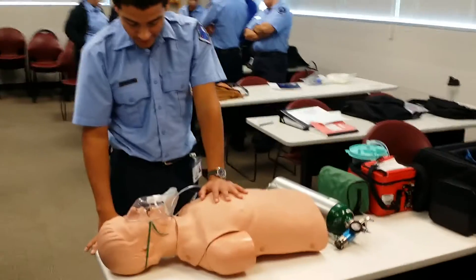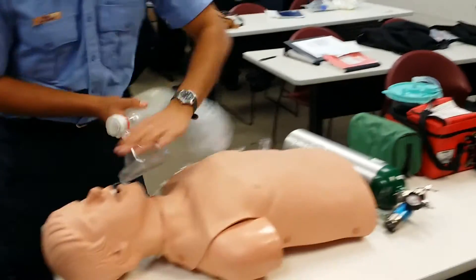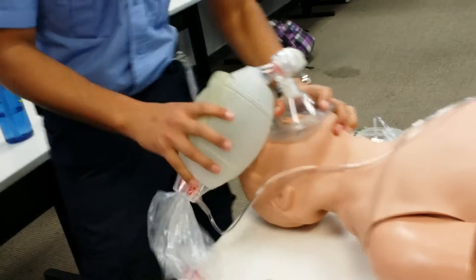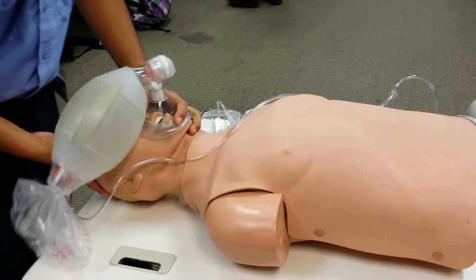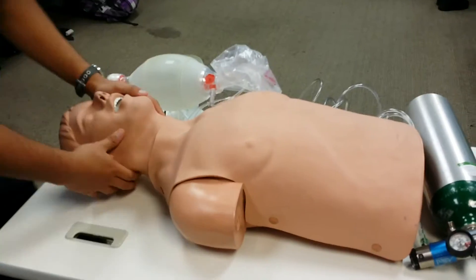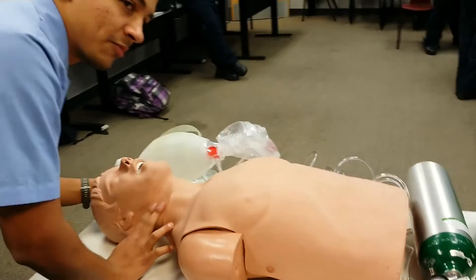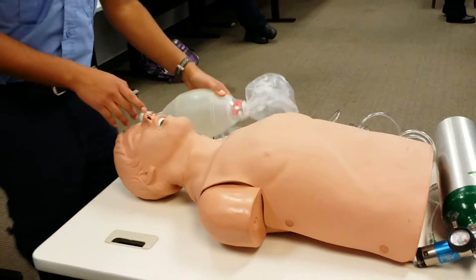Patient goes unconscious. Sir, sir, you okay? I'm going to check his ABCs. I'm going to check his airway using the bag valve mask. I'm going to do two prior rescue breaths — does the chest rise and fall? Does it go in? All right, I'm going to retry. Goes in. Airway is fine. I'm going to check his breathing. His breathing is faint, it's shallow — agonal. About how many breaths per minute is he getting? Less than six. And how about his pulse? He has a strong pulse.